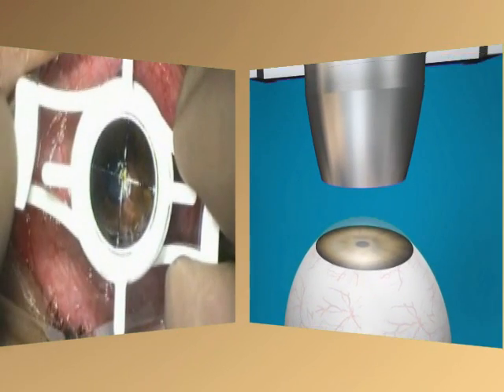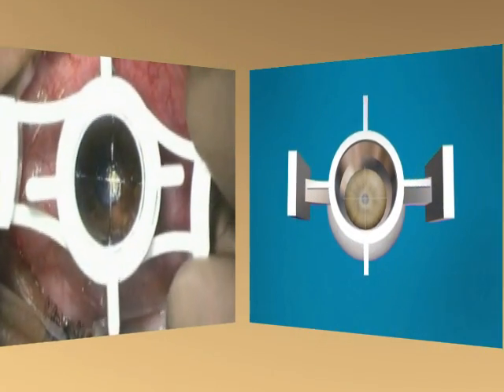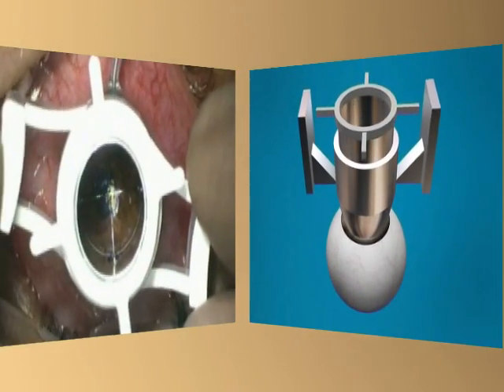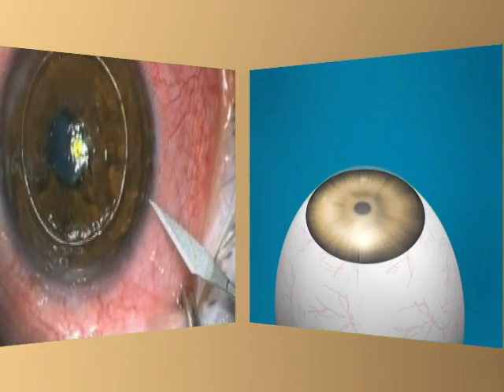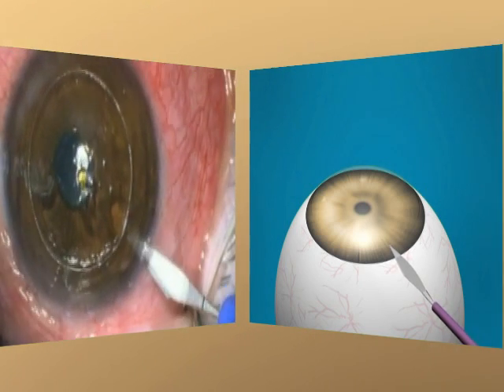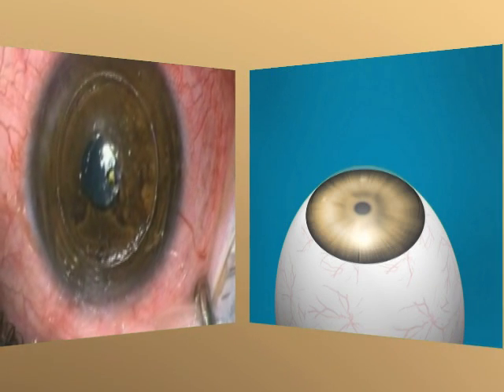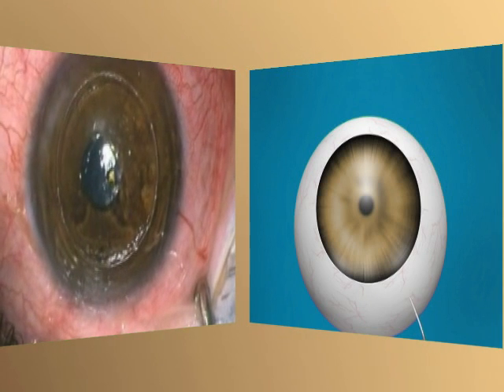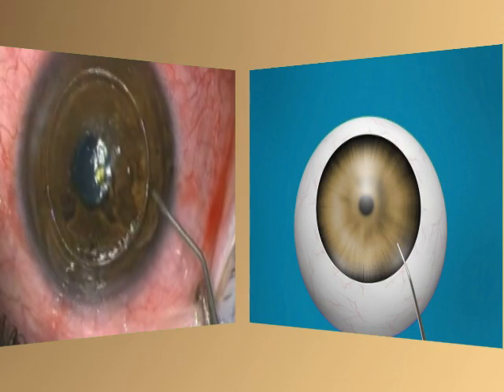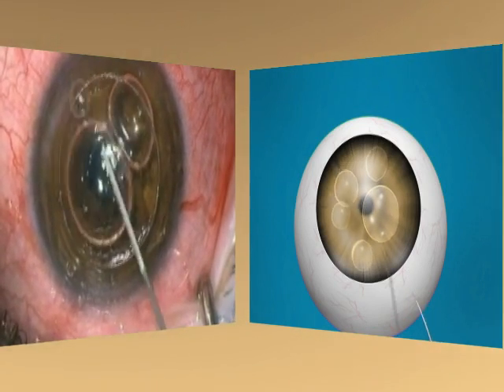A Hesburgh-Baron suction trephine was used to perform partial thickness trephination of the host cornea to an approximate depth of 60 to 70% of the corneal thickness. A self-sealing paracentesis wound was created with a 15-degree surgical blade just posterior to the limbus at 11 o'clock, and some aqueous humor was expressed. Subsequently, a small amount of air — 3 to 4 mm in diameter and 0.08 to 0.1 cc in volume — was injected into the anterior chamber.